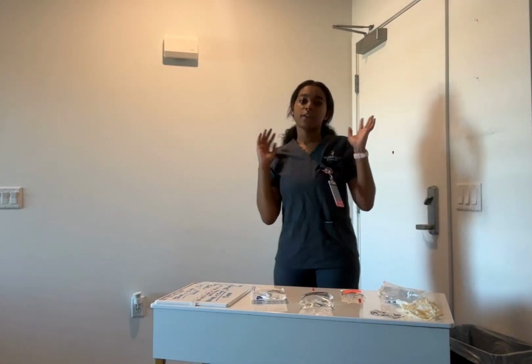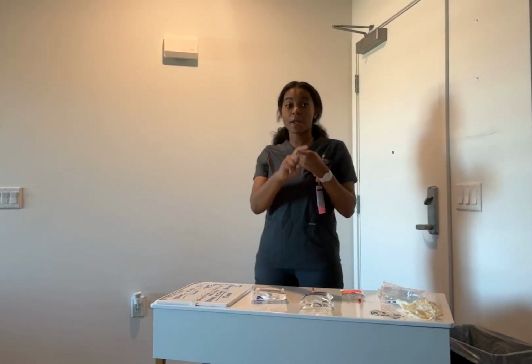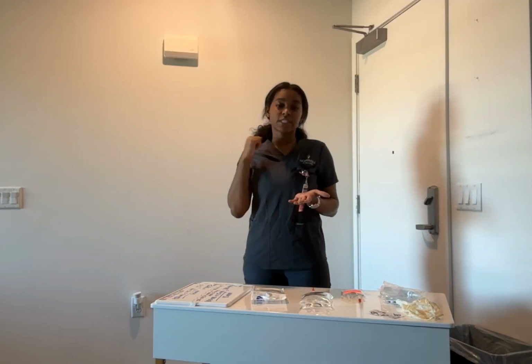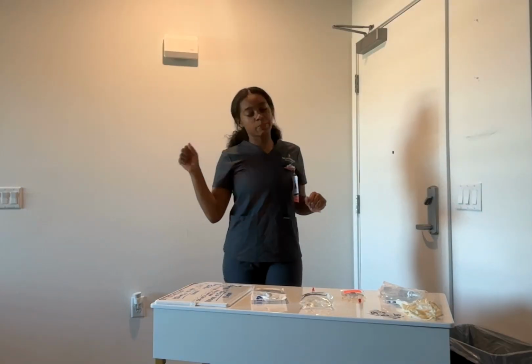So first, before I go into the room and gather my supplies, I'm going to make sure I have the 6 rights of the medication administration. So I have right patient, right drug, right dose, right time, right route, and right documentation. I'm going to gather all my stuff, and I'm going to knock on the patient's door. And I'm going to close the door behind me to provide patient privacy.